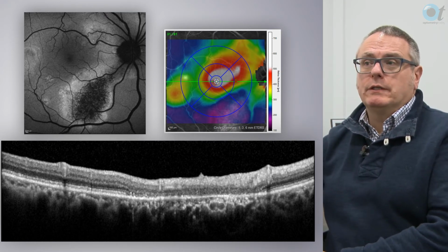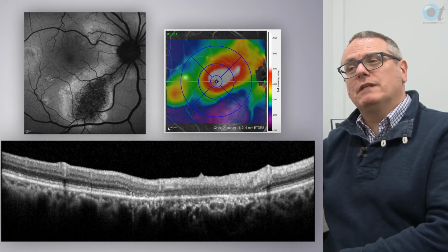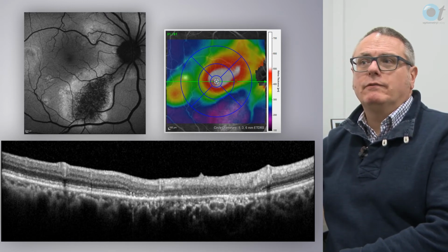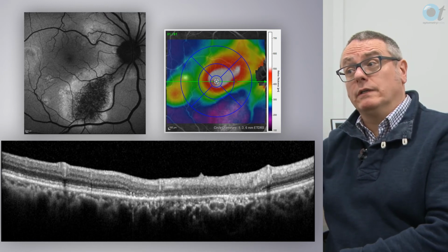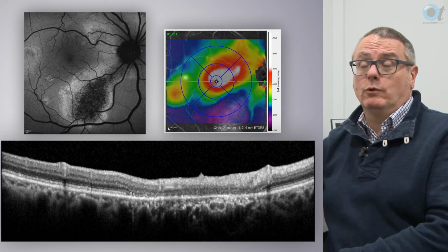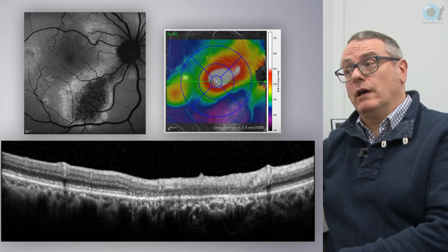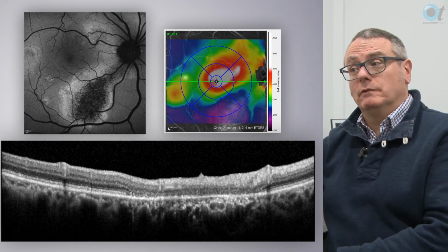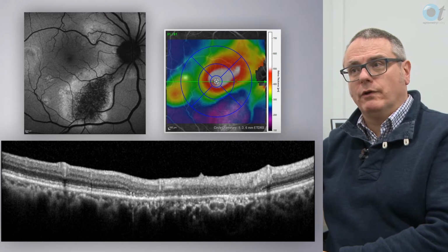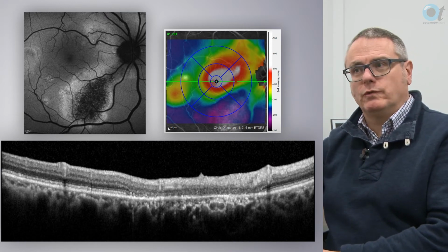Should you refer a patient with central serous retinopathy on or consider monitoring them in practice? Well, central serous retinopathy is not a benign condition. If left unchecked, you can end up with widespread photoreceptor and RPE atrophy, as shown in the image here. Again, the autofluorescence image shows widespread RPE changes, and you're also seeing atrophy on the RPE map, and the OCT cross-section is clearly abnormal. So, in all cases, consider referring on, particularly if you cannot eliminate the possibility of another cause for the subretinal fluid.